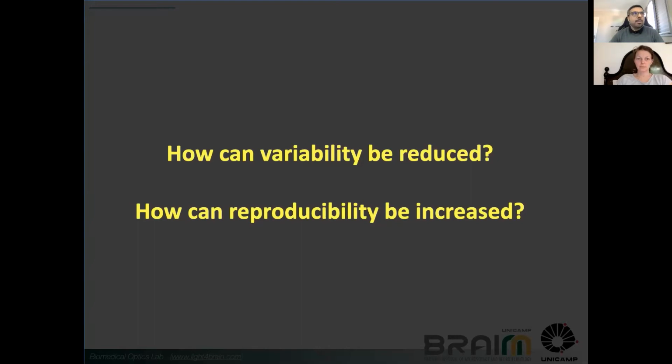So one question is, what if the person gets better at the task? When you repeat the same task, you're really not repeating the same thing, but rather the person gets training on it at each repetition. So really you're not measuring the same thing. And then there's a second question. Okay. So maybe you answer this one because the second is different.